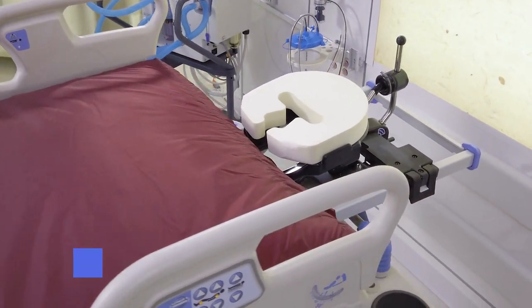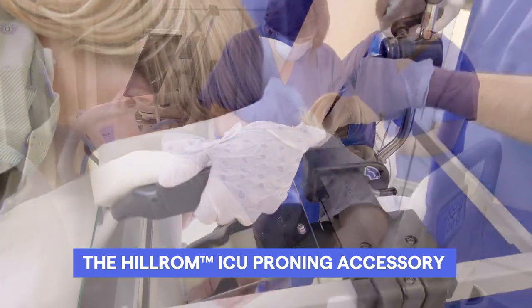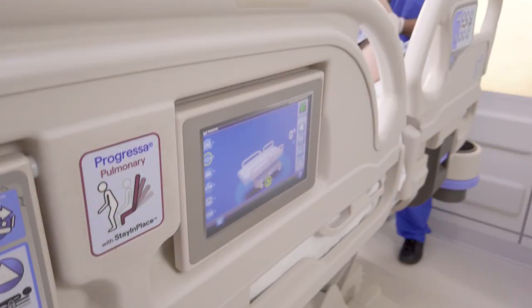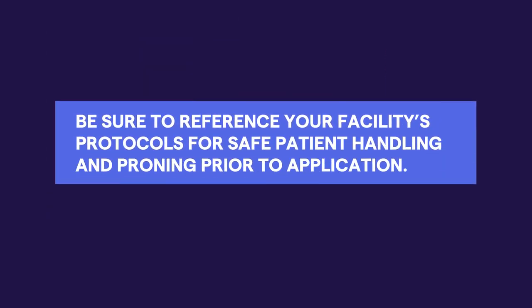The Hill-ROM ICU proning accessory was designed with a focus on patient comfort and caregiver ease of use. This tutorial will demonstrate proper installation and recommended use on a Hill-ROM Progresa smart bed frame. Be sure to reference your facility's protocols for patient handling and proning prior to application of the accessory.